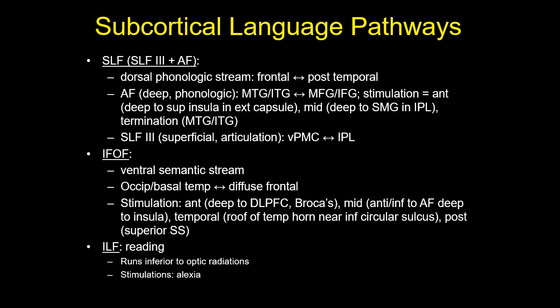and can be found during stimulation at its anterior extent deep to the insula in the external capsule. At its midpoint, deep to the supramarginal gyrus in the inferior parietal lobule. And at its posterior inferior termination within the junction of the middle and inferior temporal gyri.